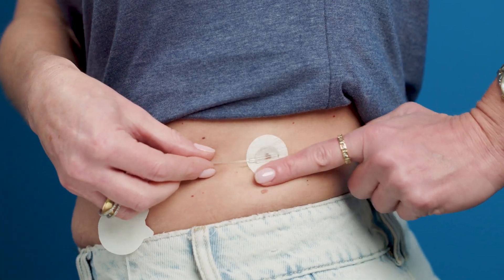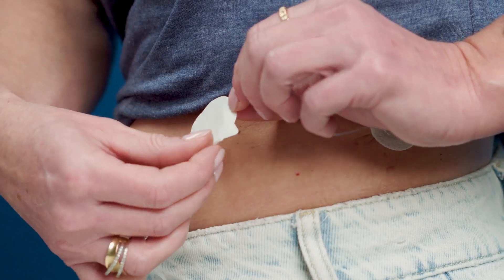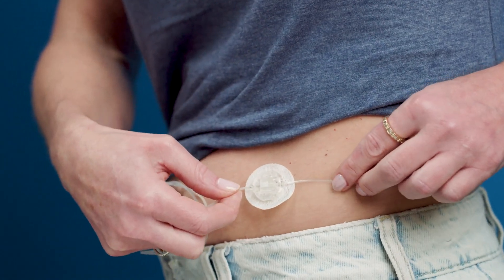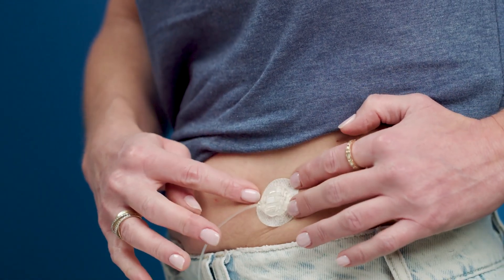Once the needle is in, press down on the adhesive tape to secure it in place. Then remove the paper backing from the anchor patch and press it onto your skin. Choose a location that makes it easy to disconnect when needed and make sure the tubing between the infusion set and the anchor patch isn't too tight.